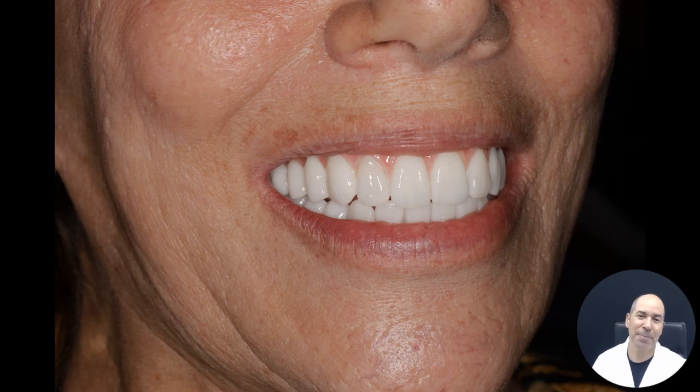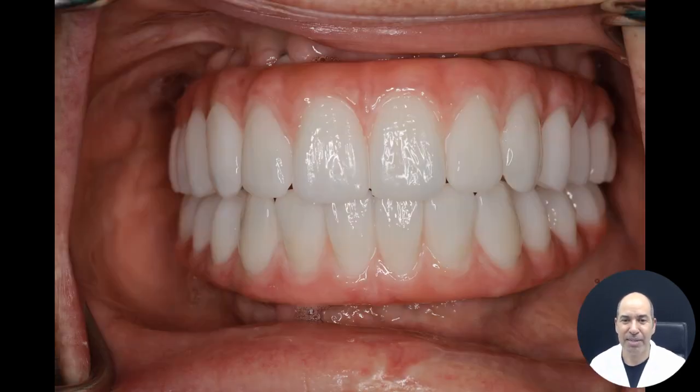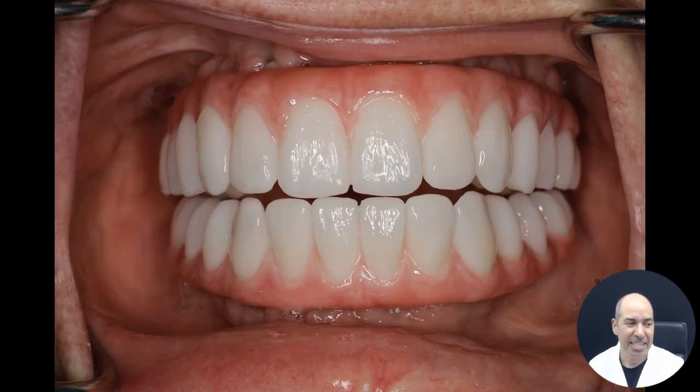And these are really close-up pictures, right? These are not far away. They're right up close. Everything fits the gum line. There's no gap. If you have a gap, there's an article on the gap space you can read about as well. And teach her how to clean it and then maintain it.